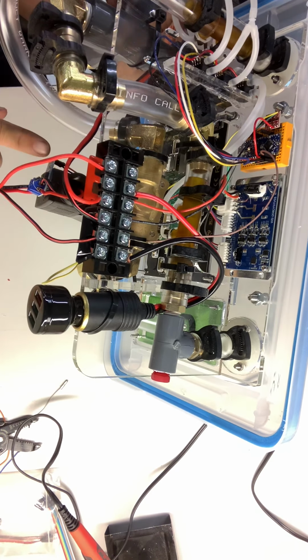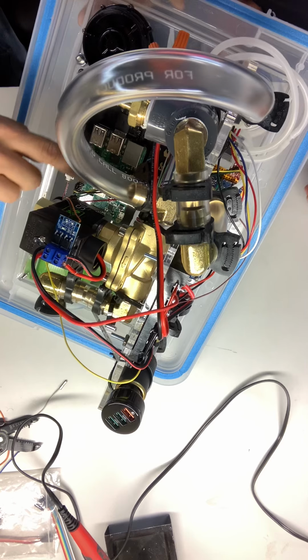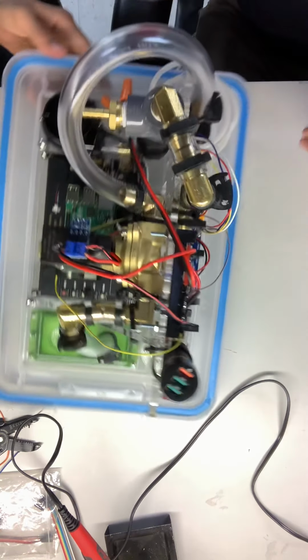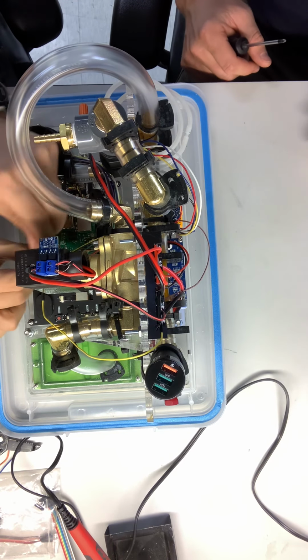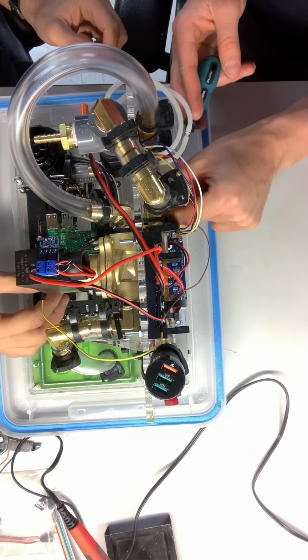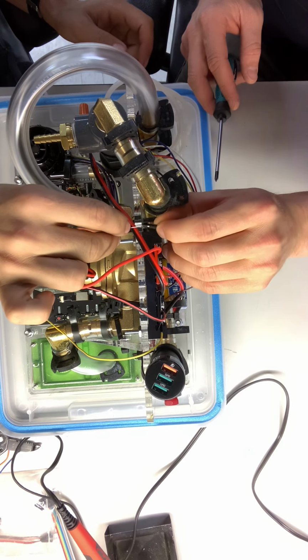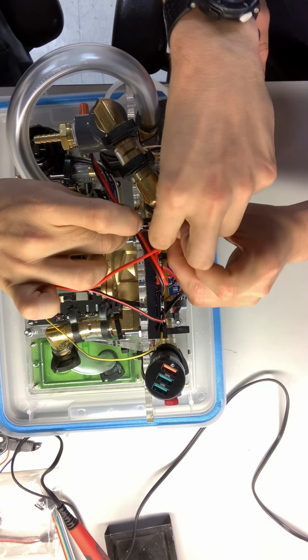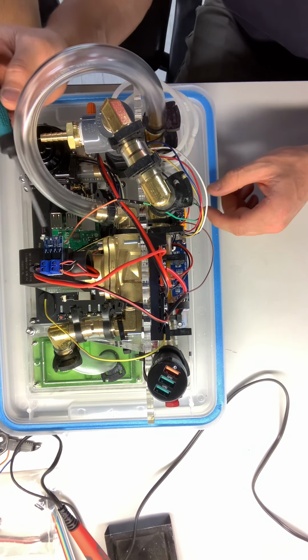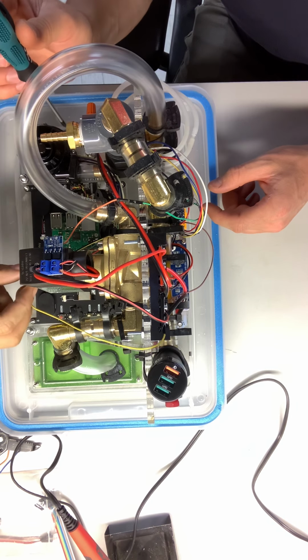Well, it's an on-off, right? Right now we have enough cable to reroute this, and maybe it's worth it. This is the signal wire, and it's running under the solenoid, basically. Let's reroute it. It'll fit over the top. Can you just connect that? Yeah, because I put a short one on. Okay, so then pull the green wire out. And then that should route over here. Perfect. Now we are electromagnetically clear. So that's the signal, and then that ground is just going around here.